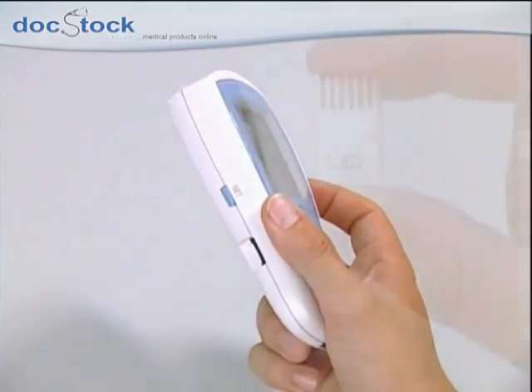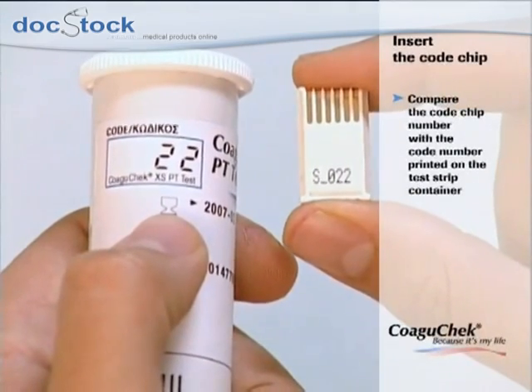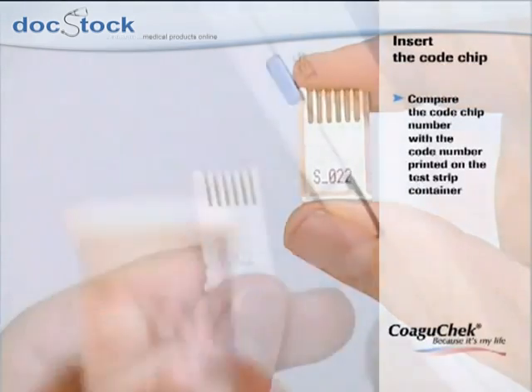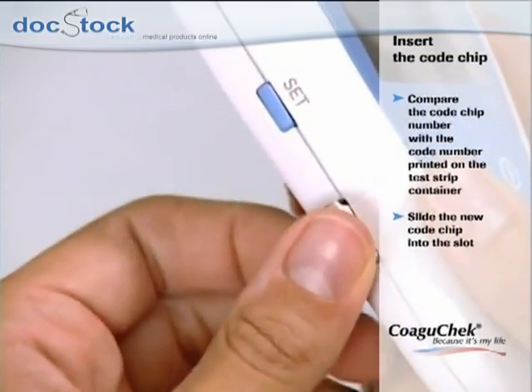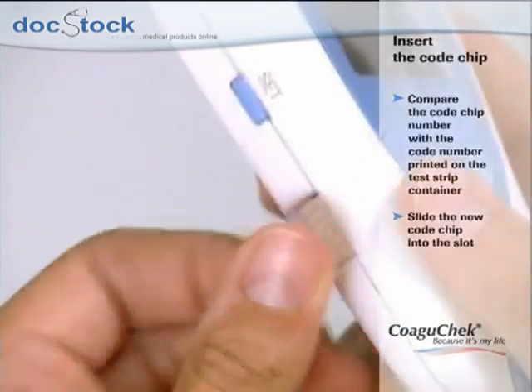Please always ensure that the number on the code chip matches the number of the label on the test strip container. Slide the new code chip into the slot on the side of the monitor until you feel it snap into place.